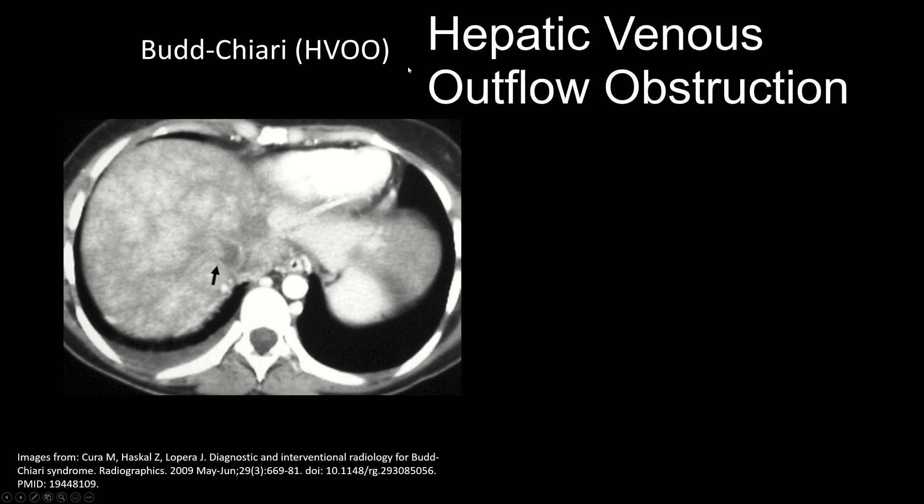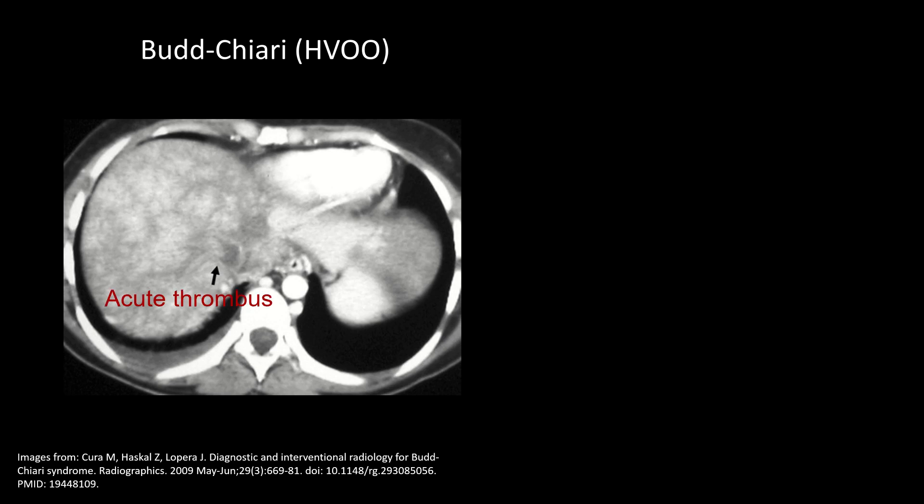Second is Budd-Chiari syndrome, also known as hepatic venous outflow obstruction. This is what happens when there is obstruction of the IVC or hepatic veins. There are many causes, but essentially you have outflow obstruction at the level of the hepatic veins centrally — this could be acute thrombosis or other chronic causes. You again see this heterogeneous hepatic enhancement related to venous congestion and the nutmeg appearance of the background liver.